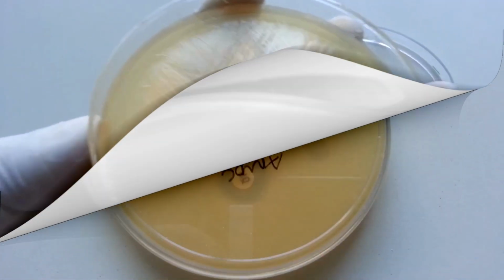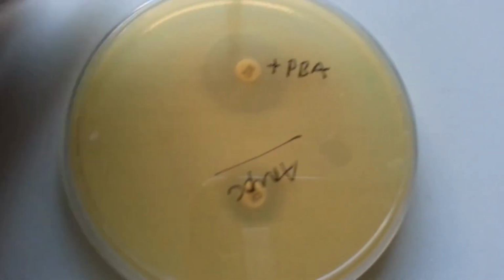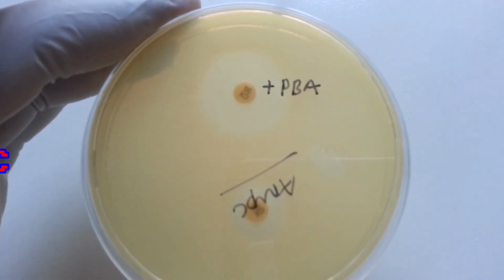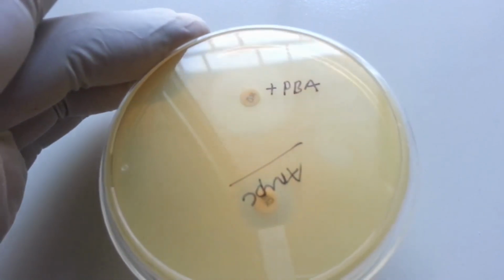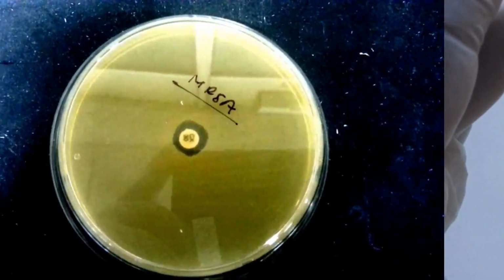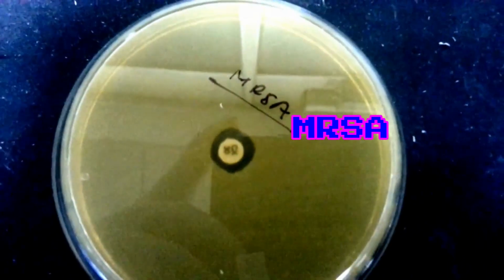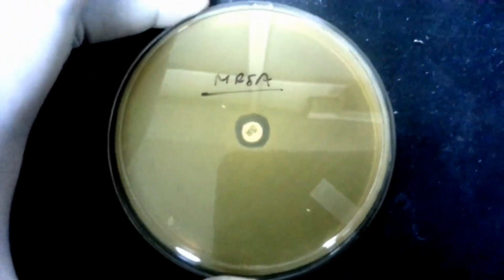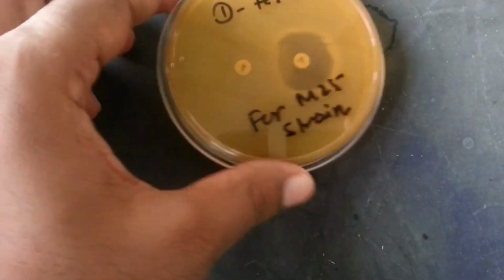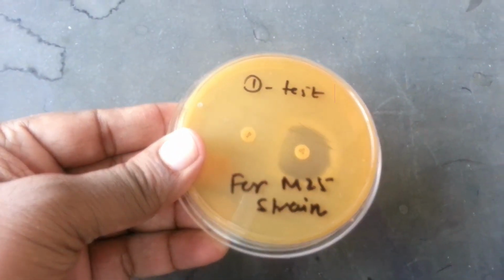Similarly, Ampicillinase, in brief AmpC. Oxacillinase 48, in brief OXA-48, plus Methicillin resistant Staphylococcus aureus, in brief MRSA, and finally D zone test for iMLSB strain, that is induced macrolide lincosamide streptogramin B strain.